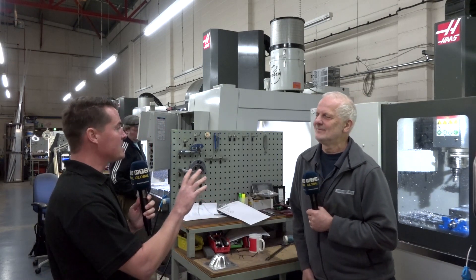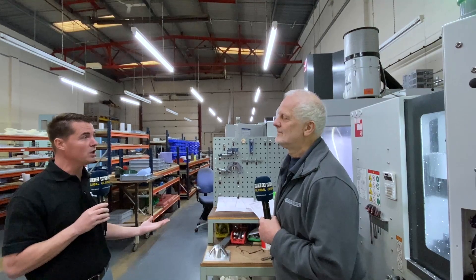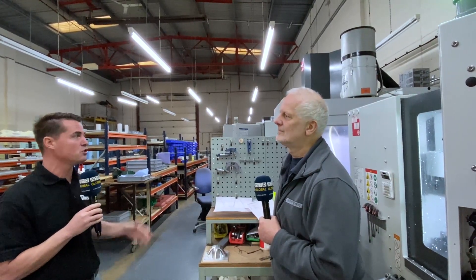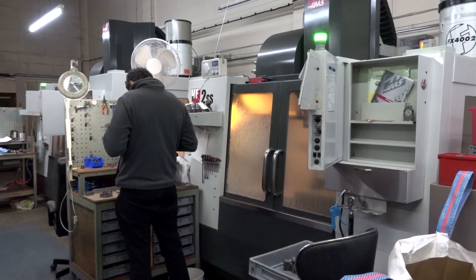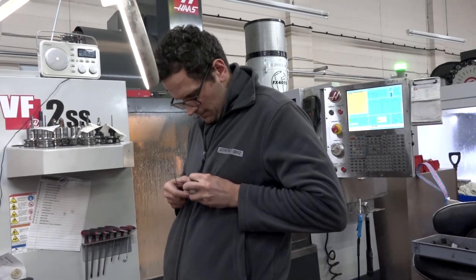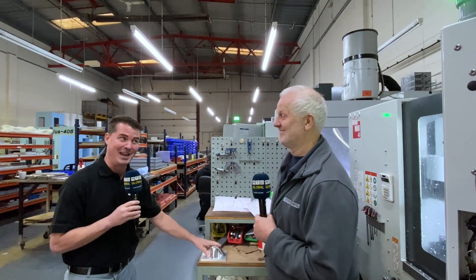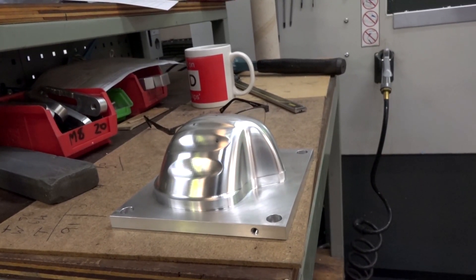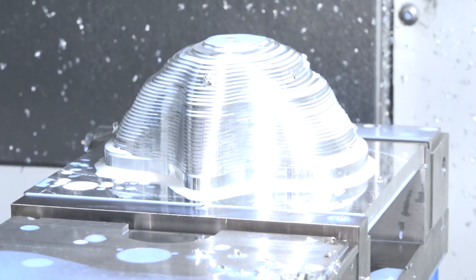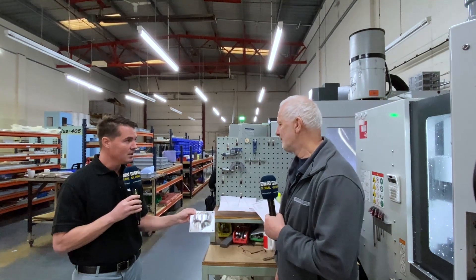As a segue to what we were working on earlier on that lathe, we've now moved over to your Haas Mini Mill and some of your other vertical machines. Due to COVID, you now have this great opportunity to work on some face mask molds. Is that correct? That's correct.